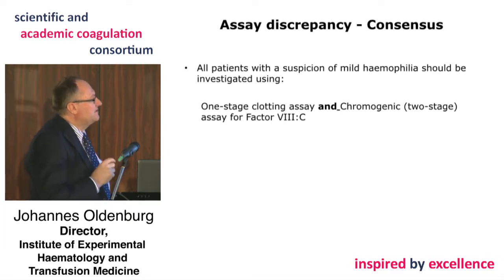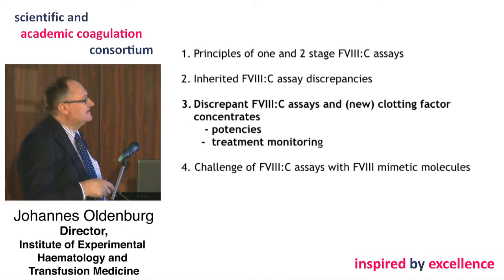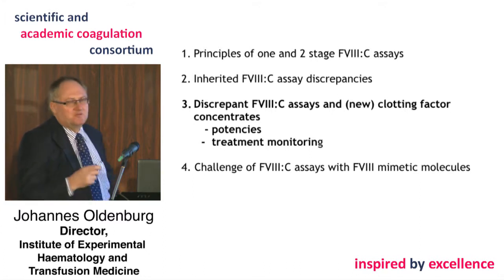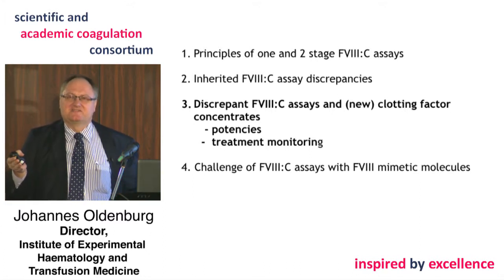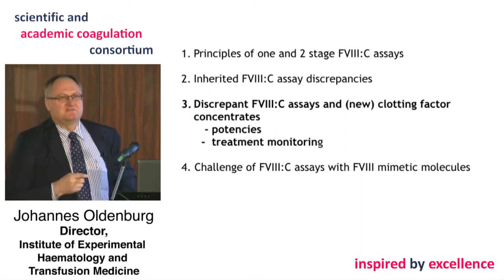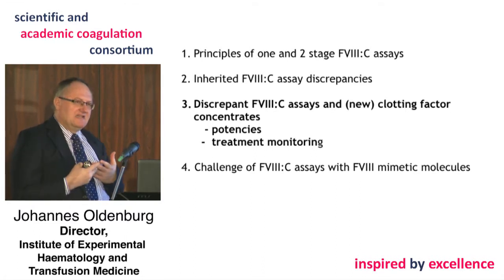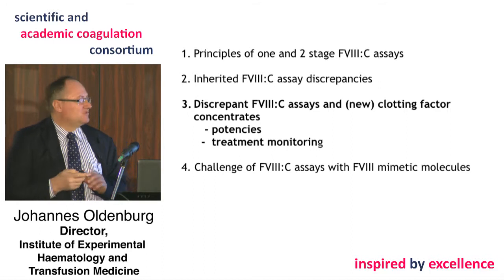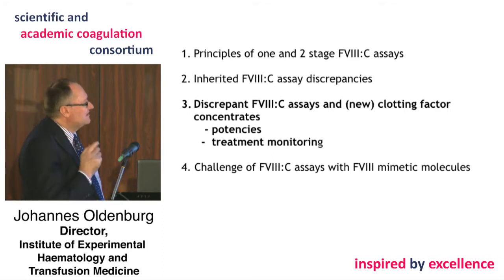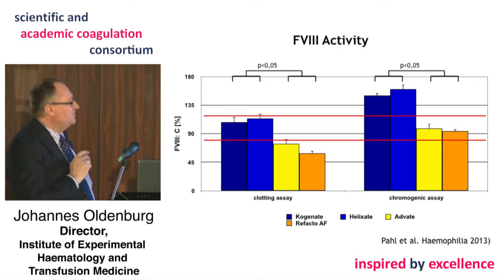Okay, now I would like to come to the discrepant factor VIII assays with respect to defining potencies and treatment monitoring with the new clotting factor concentrates. Every 3 months now a new clotting factor concentrate is licensed and they are behaving very, very differently in the assays. So this is with the classical concentrates, and we have published this a few years ago.